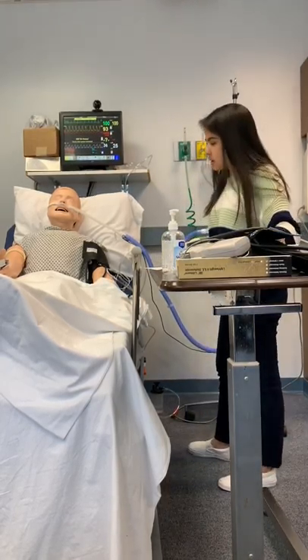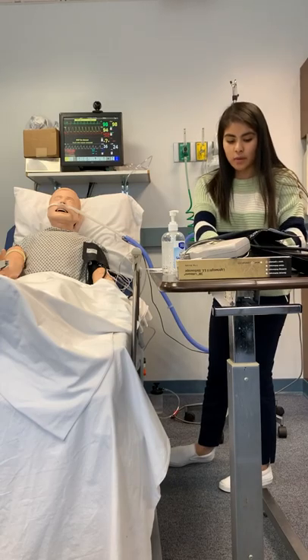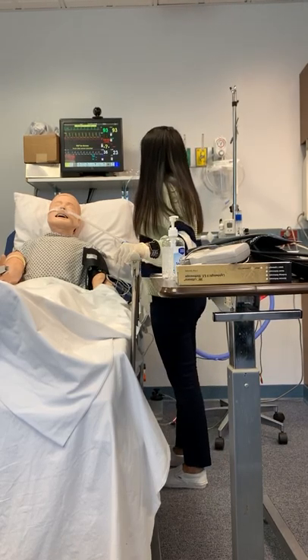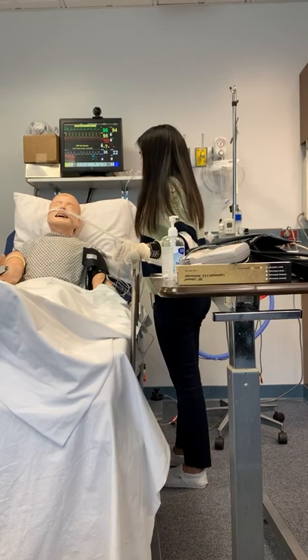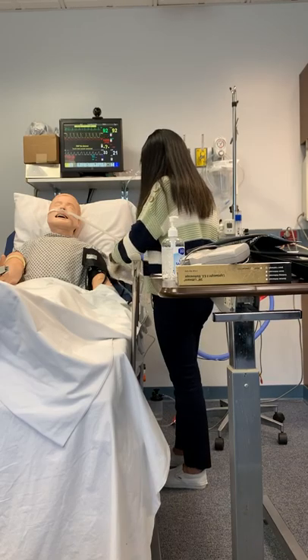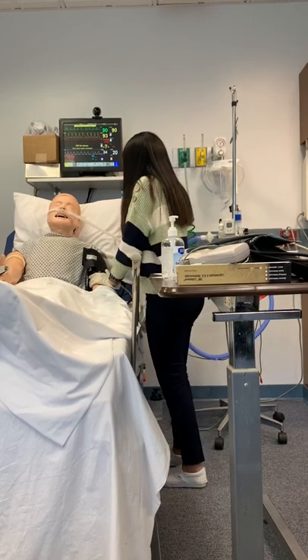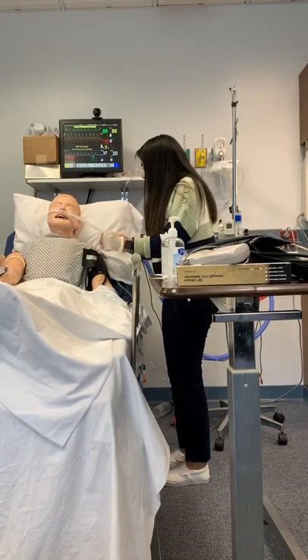Your respiratory effort looks to be decreased, which is perfect — that's what we want. So we know this is helping for sure. Your SPO2 did go up, so your SATs are going up, which is good. And your heart rate is coming back to normal. So we are doing good. You're welcome. If you need anything, just let me know. You have a nice day.